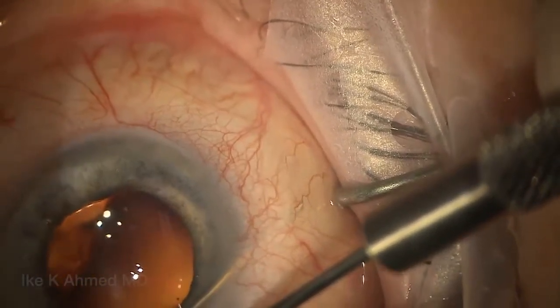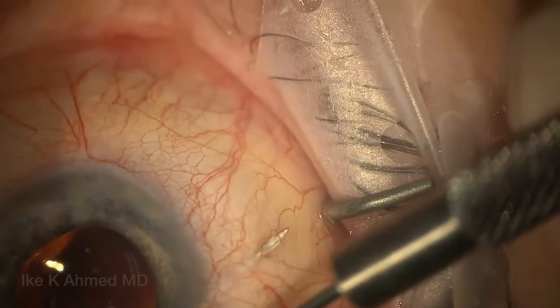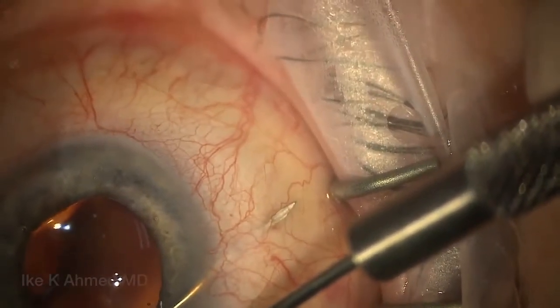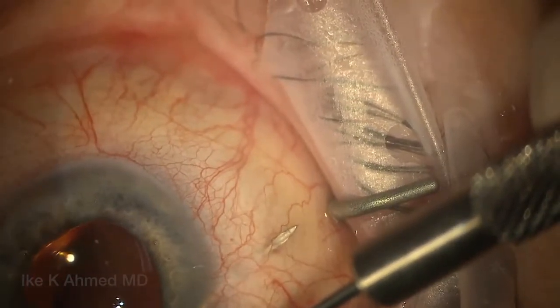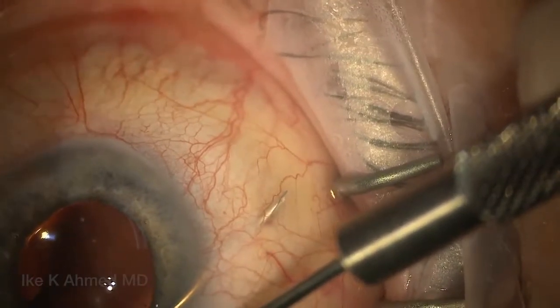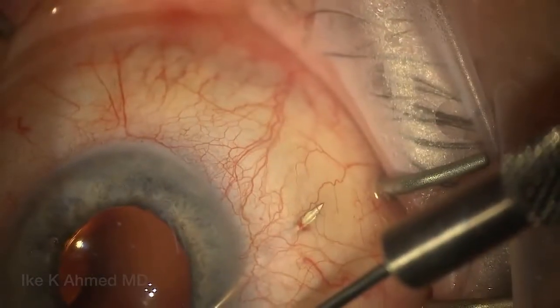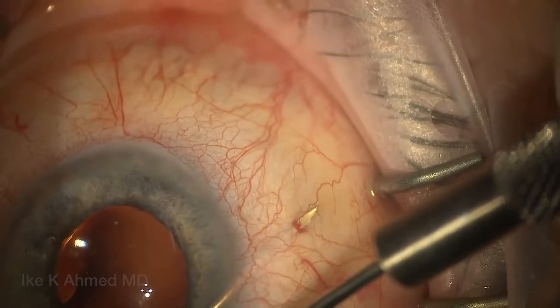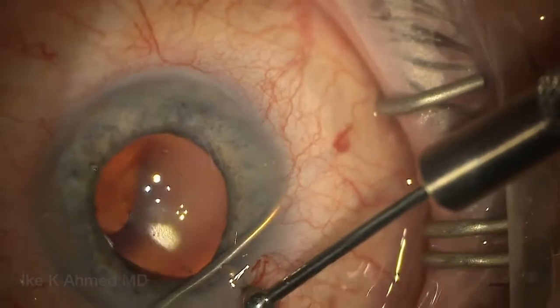I'm trying to emerge two and a half to three millimeters back from the limbus. Here we're going tangentially, of course, because we've entered the eye at the temporal position. I really try to get this needle pointing up, almost like it looks like it's going to perforate — it really doesn't because we have the tissue expanded with the mitomycin. I really want to get that needle through tenons just under conjunctiva, pushing up superficially, rotating the needle to get it tenting up the conjunctiva, so I know I'm through tenons and away from any deep tenons placement.